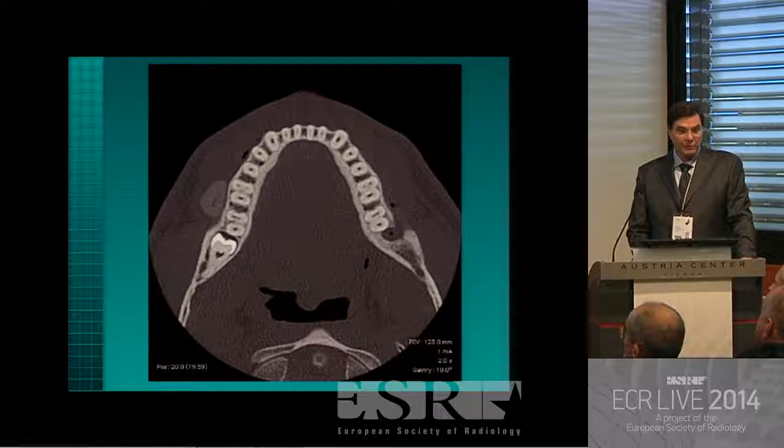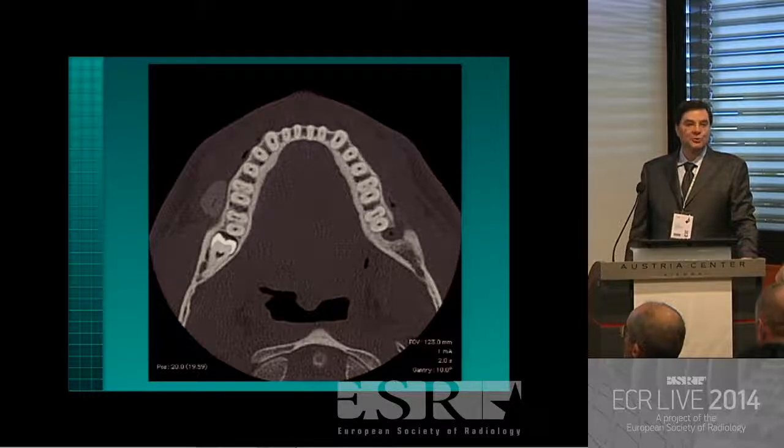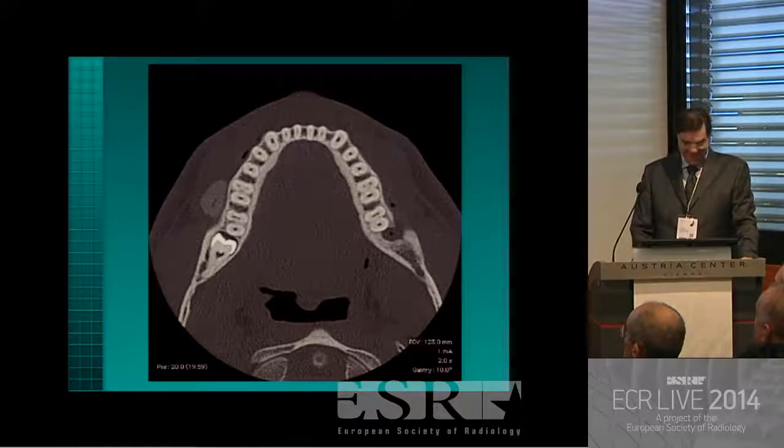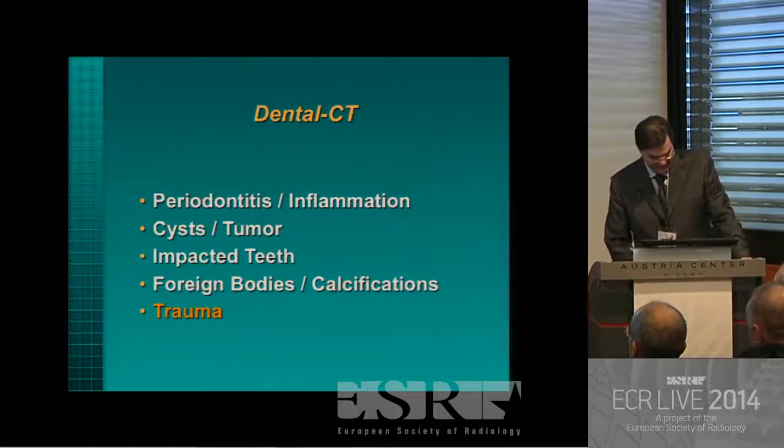Another foreign body, what do you think this is? What will be your guess? It's a chewing gum. Chewing gum. Also possible from time to time to find it by accident.